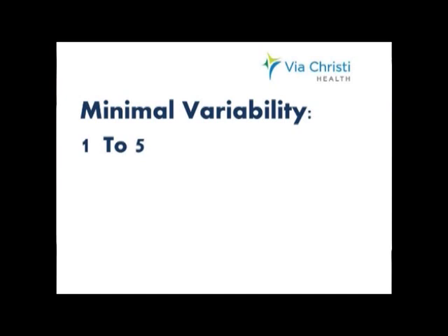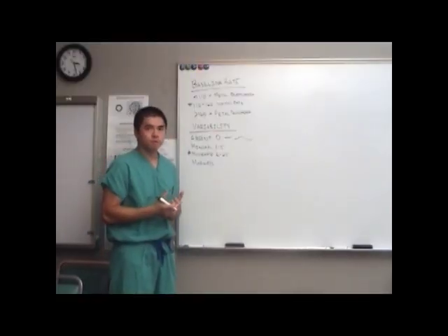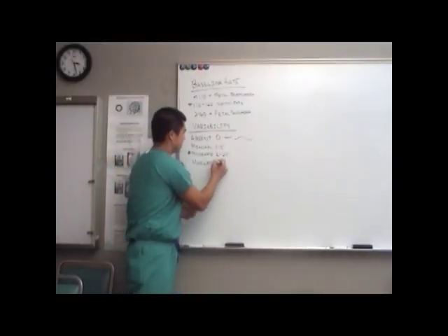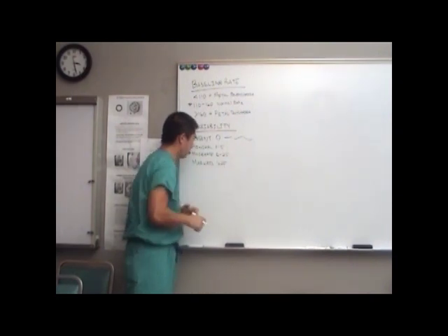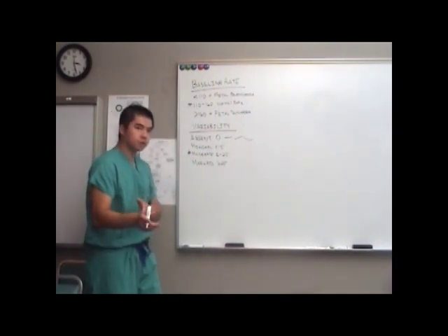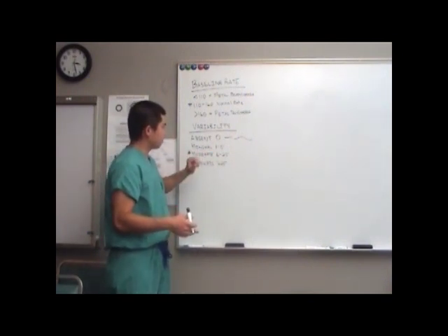Yep, 1 to 5. Okay. And then moderate, 6 to 25. And what's the amplitude for marked? Greater than 25.